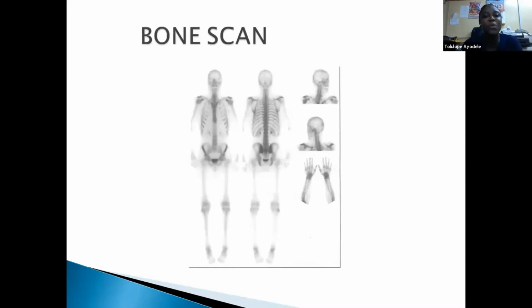This is a typical example of a nuclear medicine scan, a bone scan, whereby you could depict bone metastasis, arthritis, and even bone infections.